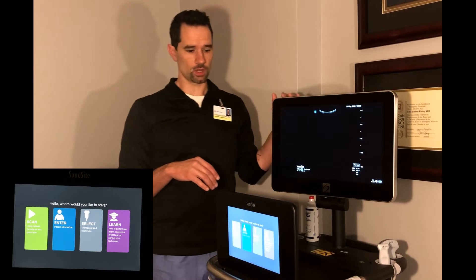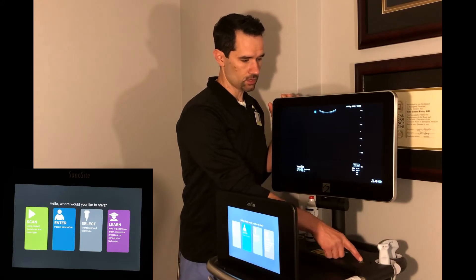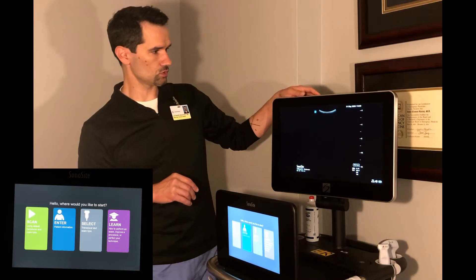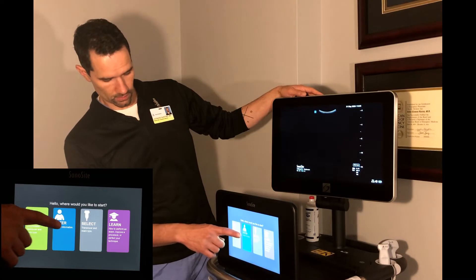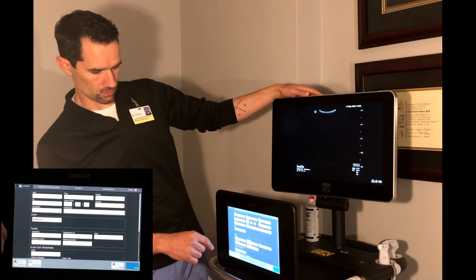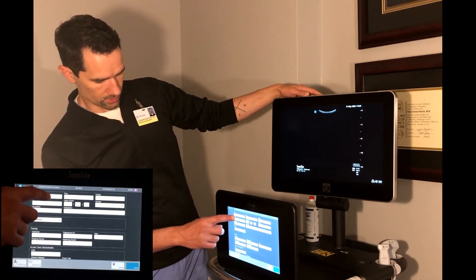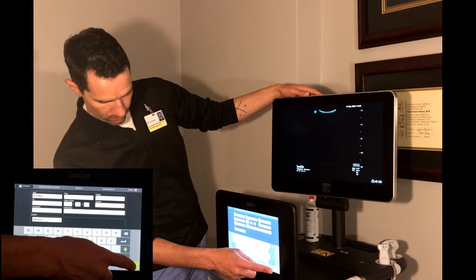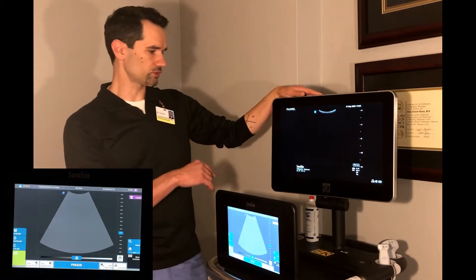When you approach the machine and you're ready to scan, just hit the on button. When you move to the touch screen, hit 'Enter Patient Information.' That will pull up a data entry field allowing you to enter patient information using an on-screen touch-sensitive keyboard. When you're done, just hit done and that'll take you to your actual scanning field.